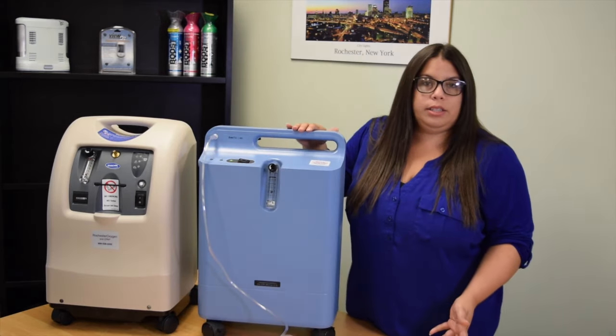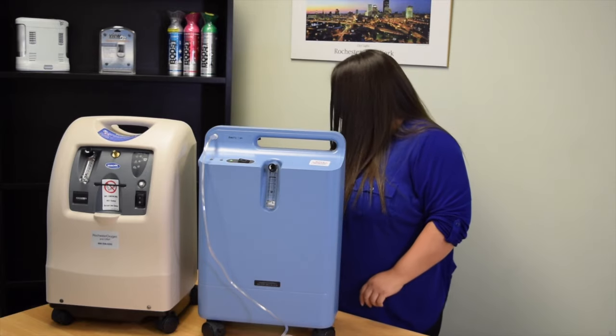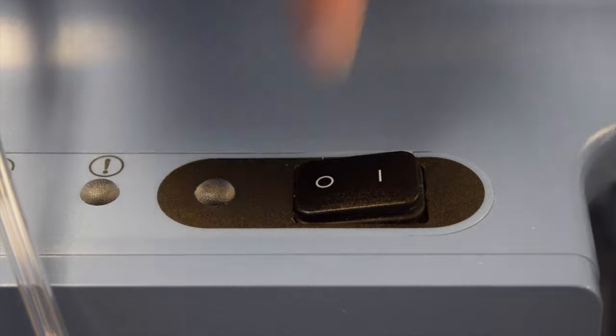In the event of a power outage, your concentrator will alarm. You'll have to turn off your concentrator to stop the alarm.